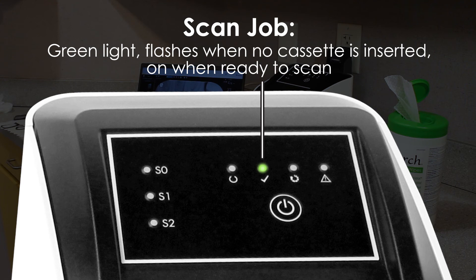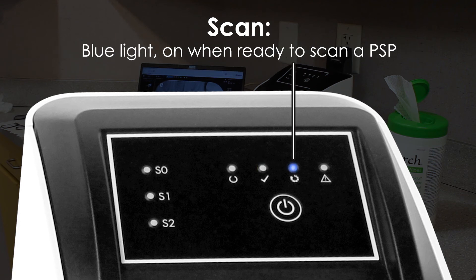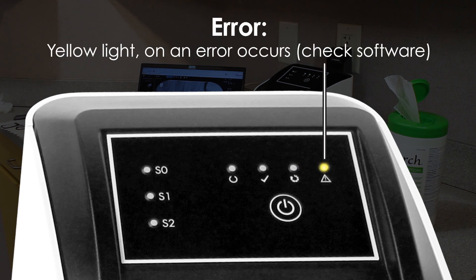However, if we forgot to insert a cartridge into the scanner prior to activating the ScanX, we will see it flash green. Once we've set the scan job from the imaging software to the ScanX Edge, the scan LED will illuminate blue indicating we're ready to insert a plate. If the system ever were to encounter an error, the error status light indicator will illuminate yellow. Please check the software status for further troubleshooting efforts.